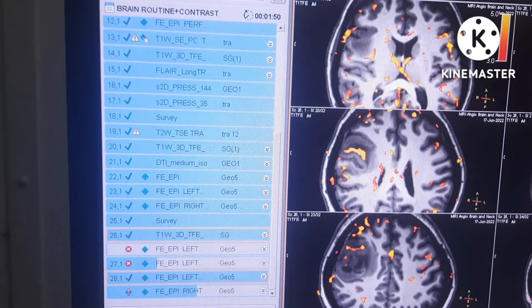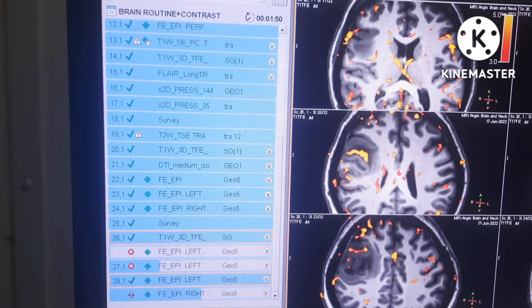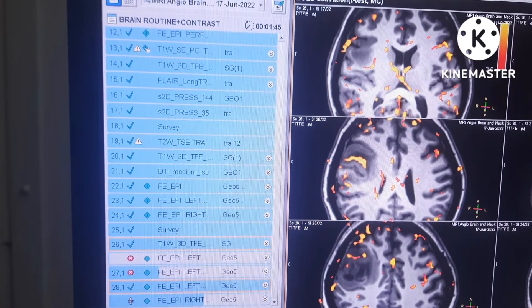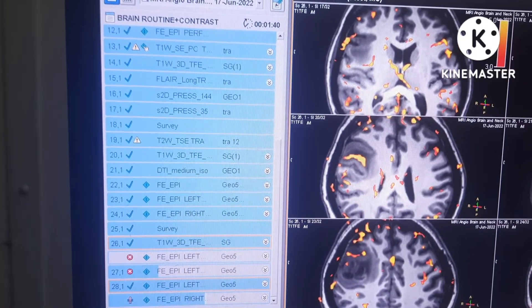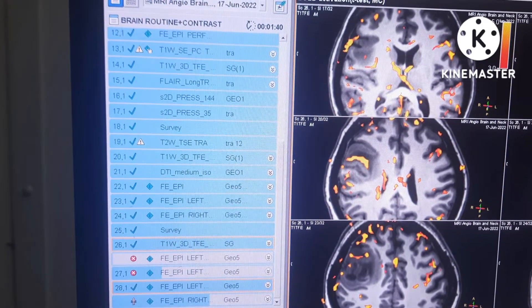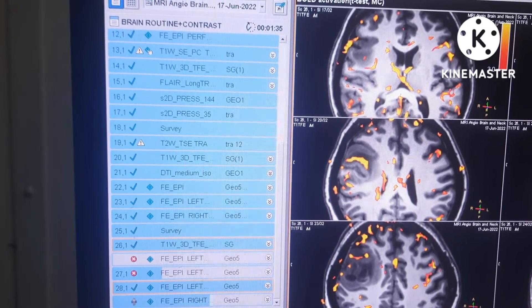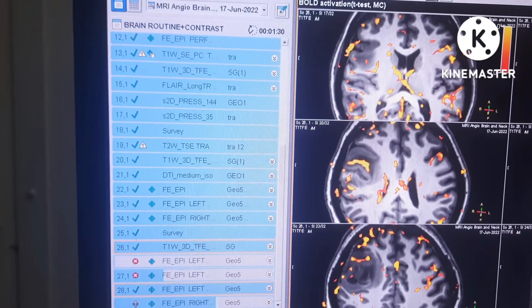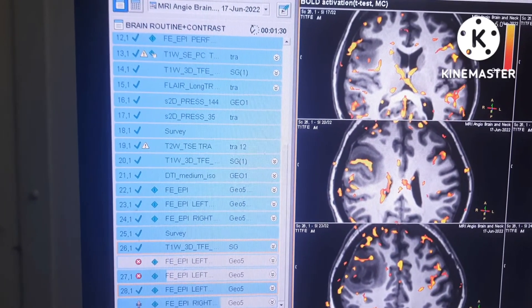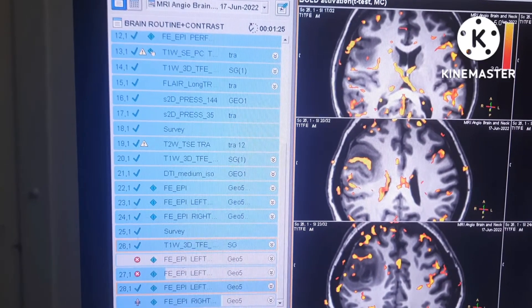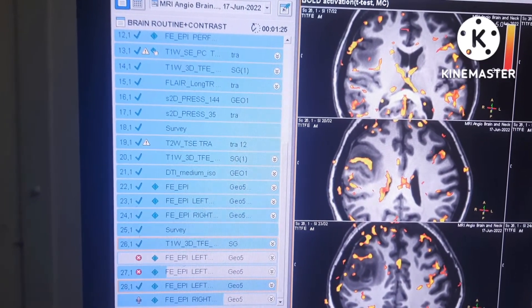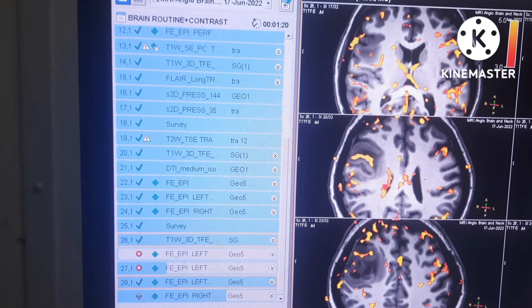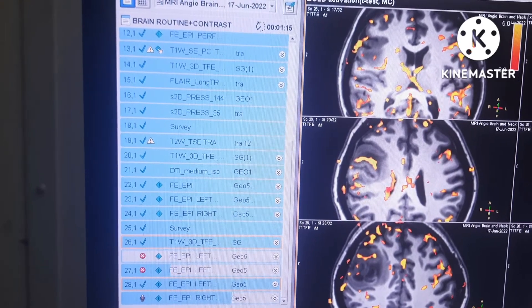On this particular patient we have taken brain plane pre-contrast T1 FS, and while giving contrast we have taken perfusion dynamic. After that we have taken DTI — diffusion tensor imaging. Then we performed spectroscopy as well, and we are doing functional MRI for the upper limb. Thank you.